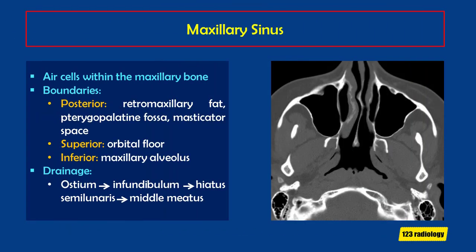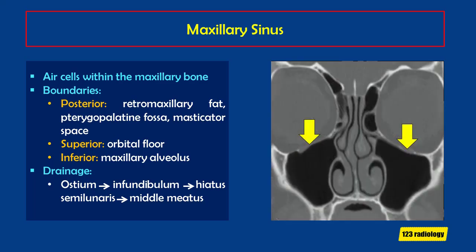The maxillary sinuses are air cells within the maxillary bone. They are bounded posteriorly by retromaxillary fat, pterygopalatine fossa, and masticator space. Superiorly, bounded by the orbital floor, and inferiorly by the maxillary alveolus. They drain to the middle meatus through the ostium, infundibulum, and hiatus semilunaris.